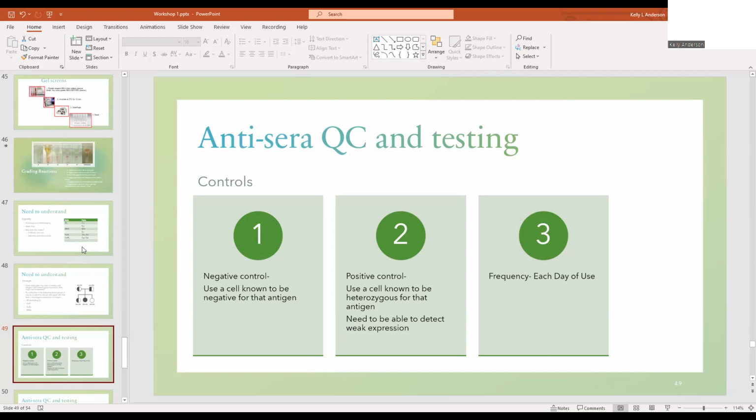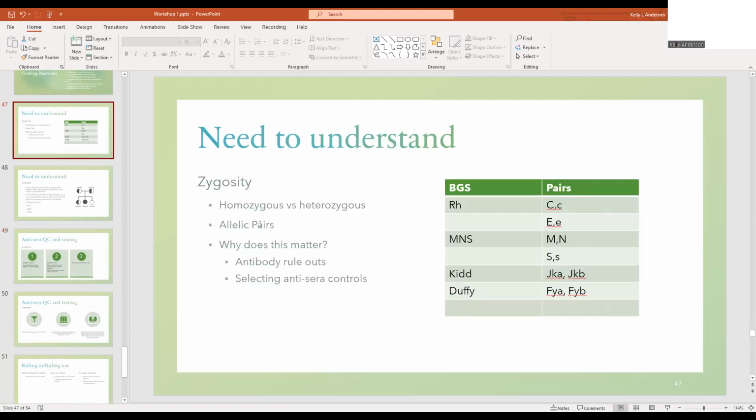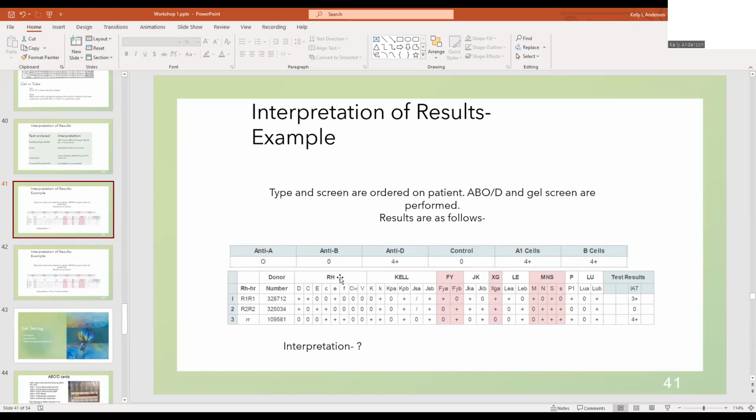So how do we know if something is heterozygous or not? So you need to know the allele pairs, basically. So all these are pairs. So when you're looking at a cell, you need to know which ones go together. Because basically, if you're looking for a heterozygous, big K and little k are allelic pairs. If both are positive, they are heterozygous for both big K and little k. If you're looking at cell 2 up here, it is homozygous for little k.